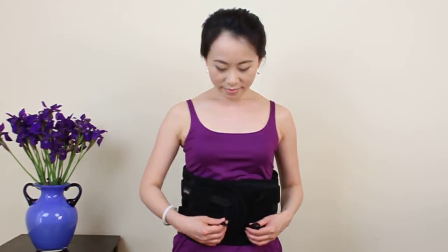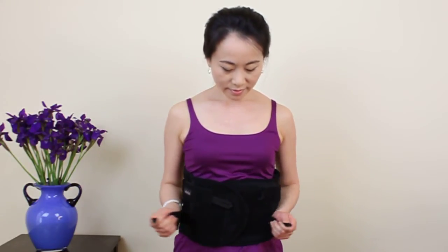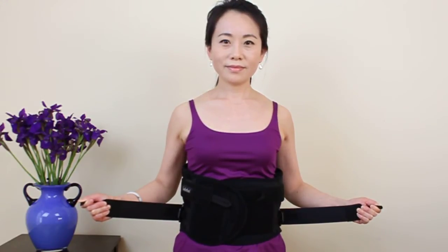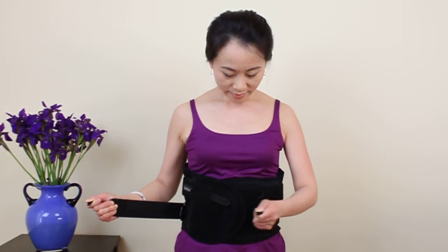Release the bottom straps and pull them away from your body until the appropriate amount of pressure is applied. Then place one strap on top of the other to secure.